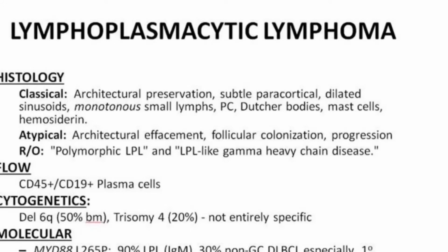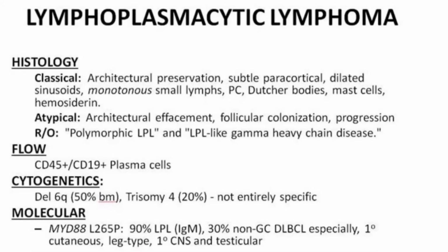So with our case, our differential diagnostic considerations really were lymphoplasmacytic lymphoma versus the other small B cell lymphomas that can have plasmacytic differentiation, and in this case, perhaps nodal marginal zone lymphoma. So in order to resolve that, I went ahead and ordered a study for MYD88 mutation, and in this case it had a very obviously positive L265P MYD88 mutation.